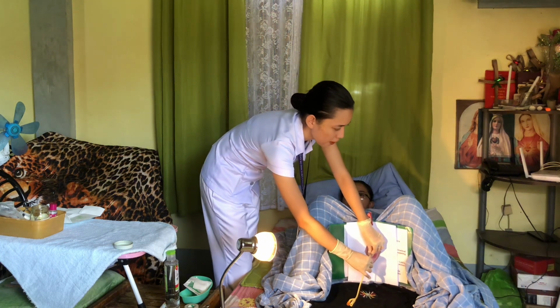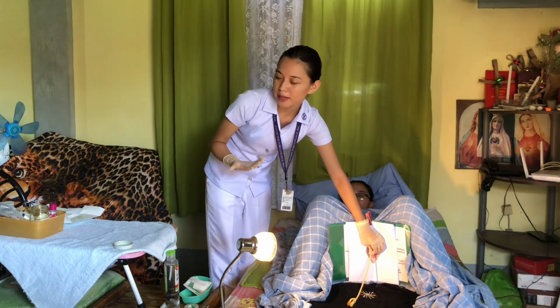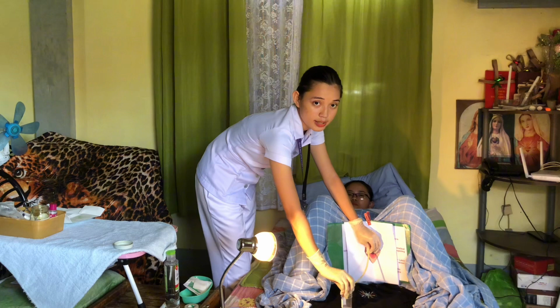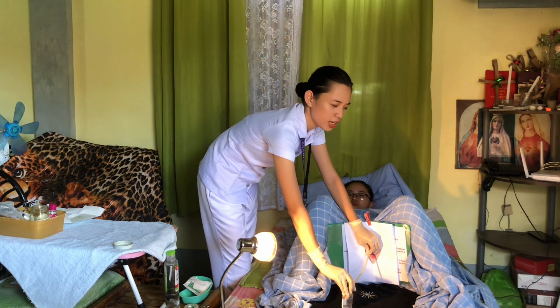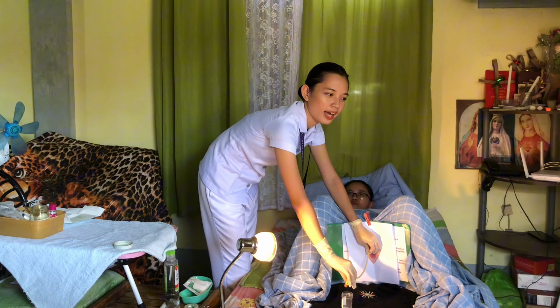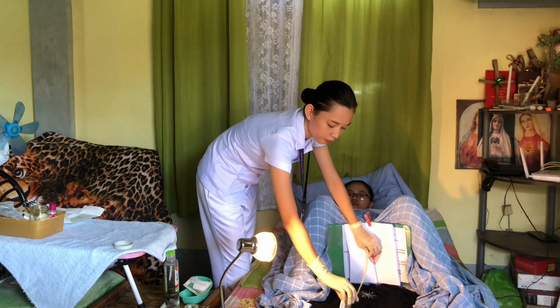Now, if the specimen needs to be collected, pinch the catheter, because the urine will flow out if the lumen is not occluded, and place the specimen container in place. Okay. So now rest the hand on the patient's pubis while holding the catheter in place to avoid pushing and pulling the catheter, because withdrawing and pushing the catheter back in the urethra may cause an infection on the urethra. The next thing that I am going to do is to connect the catheter and the urine bag.